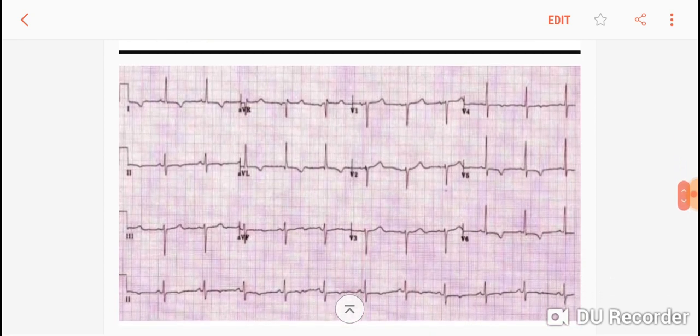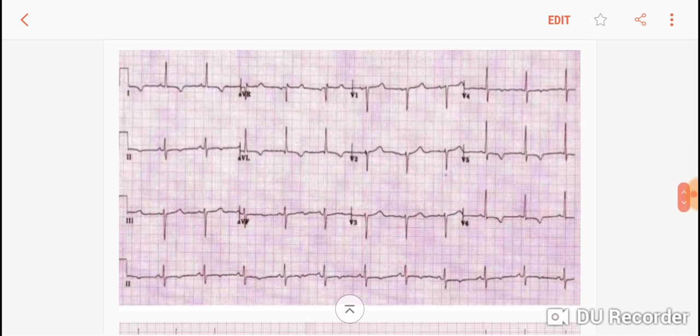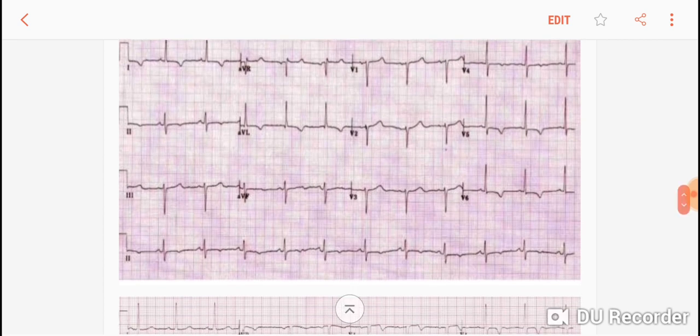Right here, remember the previous STEMI video, a particular segment of leads shows where it is happening. So right here we have T wave inversions you see in V4, 5, 6, AVL and lead 1, so it is a lateral wall NSTEMI. It shows lateral wall ischemia.